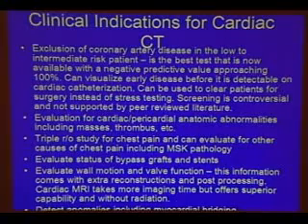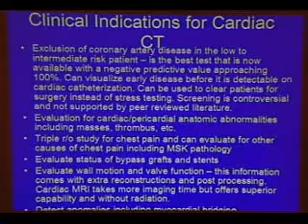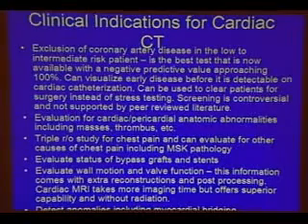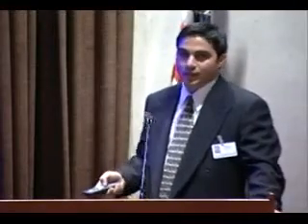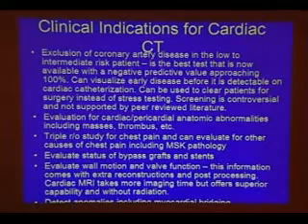Now, what I wanted to talk to you about very quickly here is which are the indications for this procedure. Should we do screening on everybody on this? Well, no, we shouldn't. Number one is because of the radiation that this procedure entails. Unfortunately, it is a CT scanner and it does include radiation. So typically, there's got to be some kind of risk to the patient for us to perform this procedure. The amount of radiation that we give in this study pretty much equals the same amount of radiation that you would receive with a regular catheter angiogram. So typically, we take that into consideration and we weigh the risks versus benefits of this procedure.